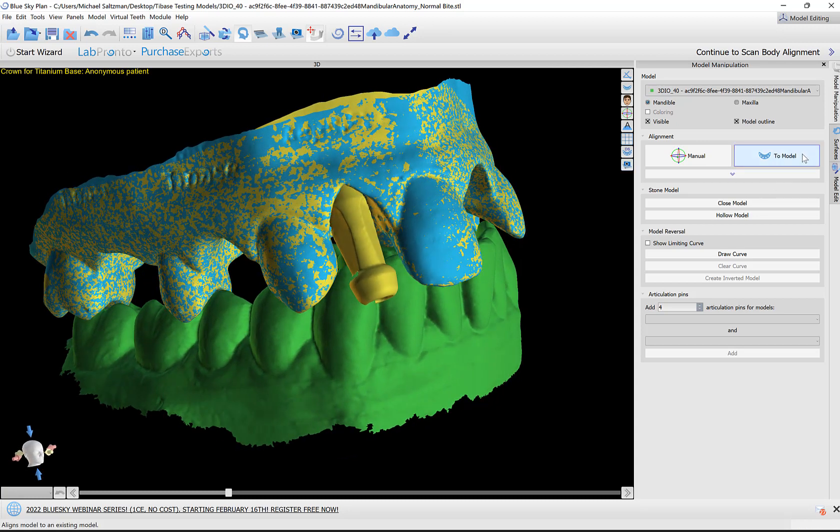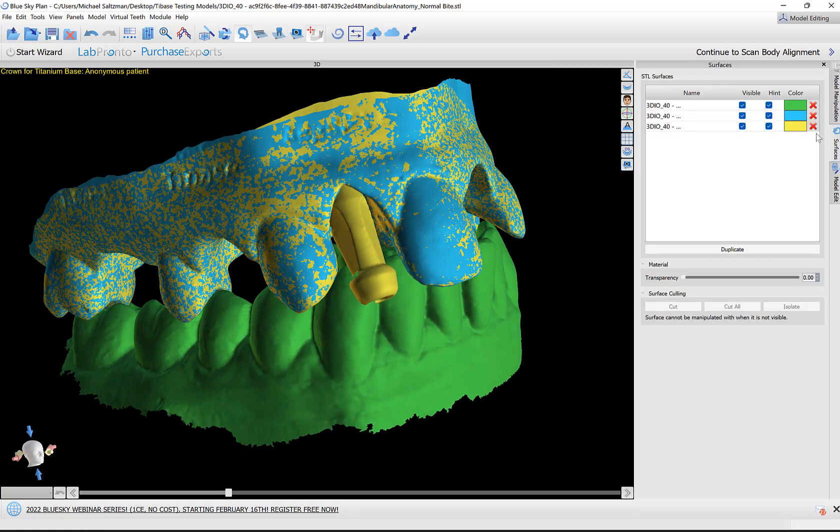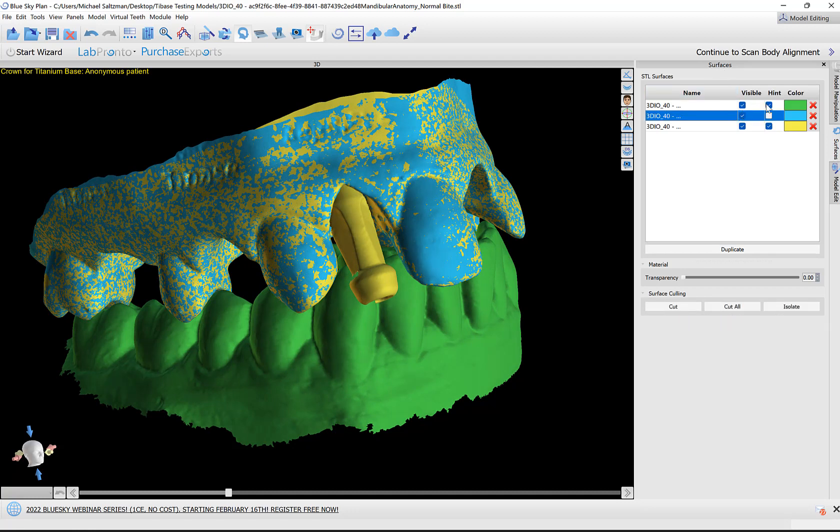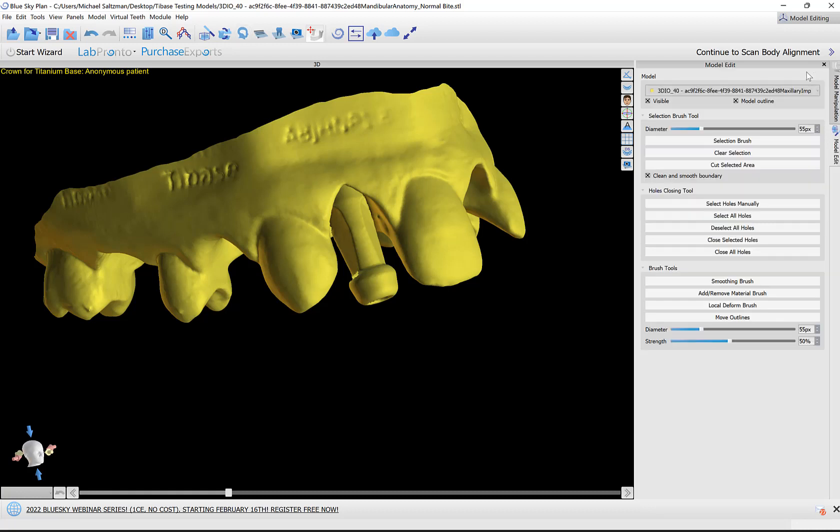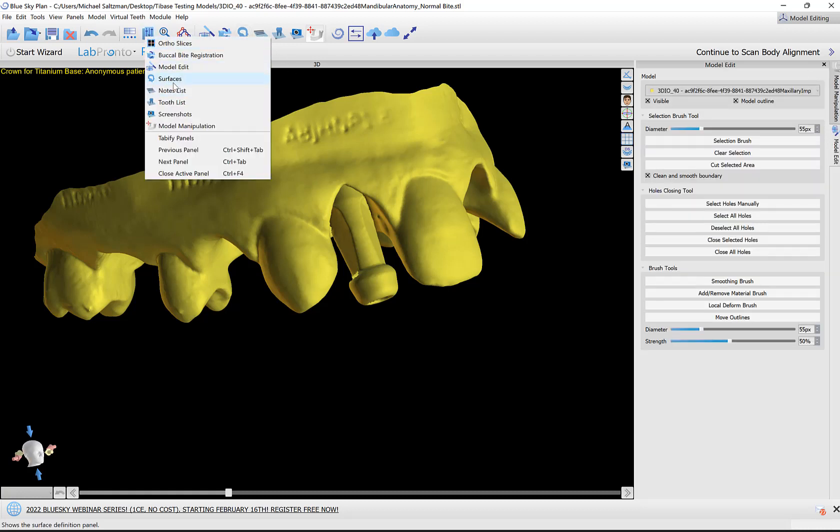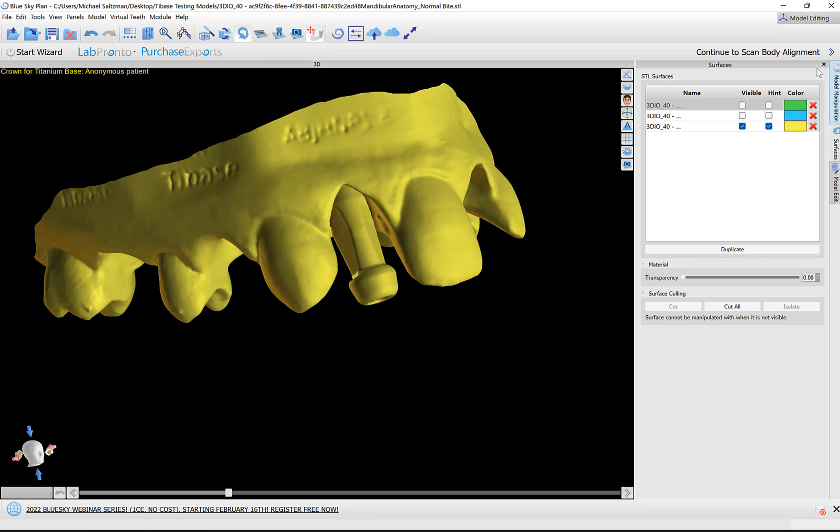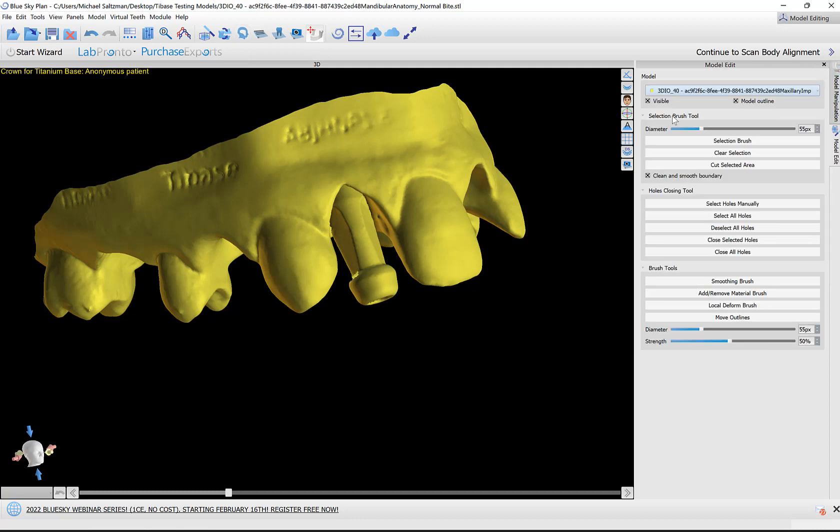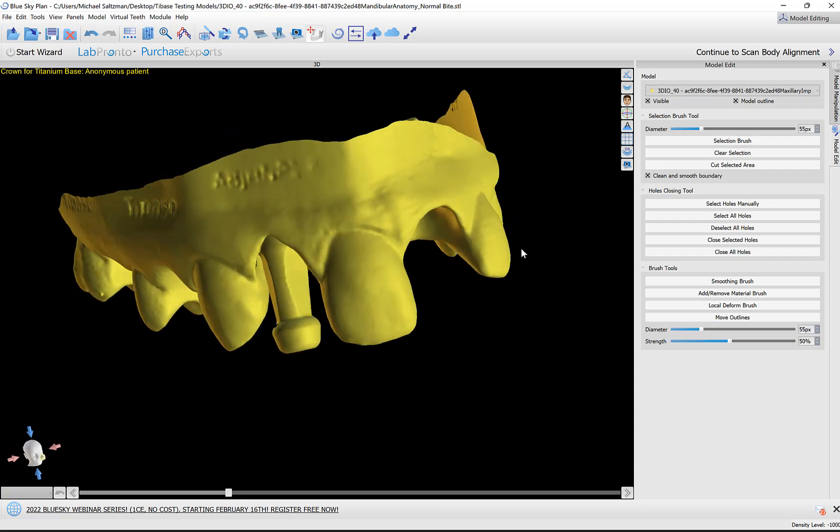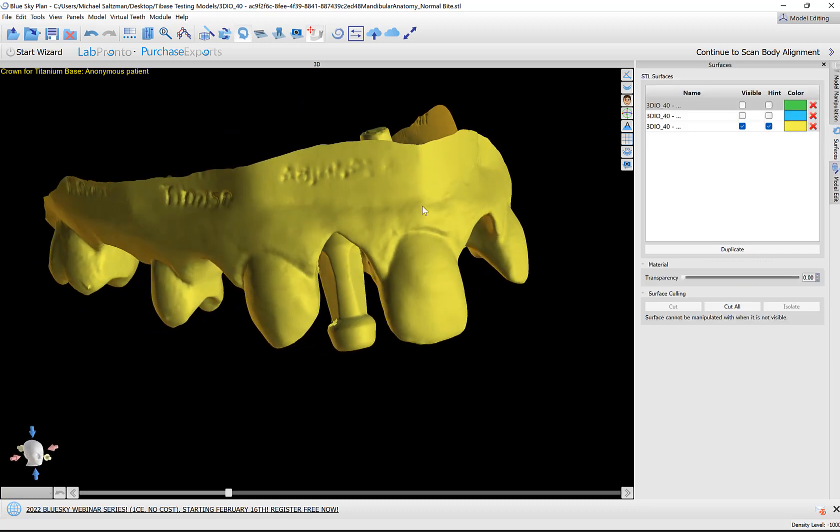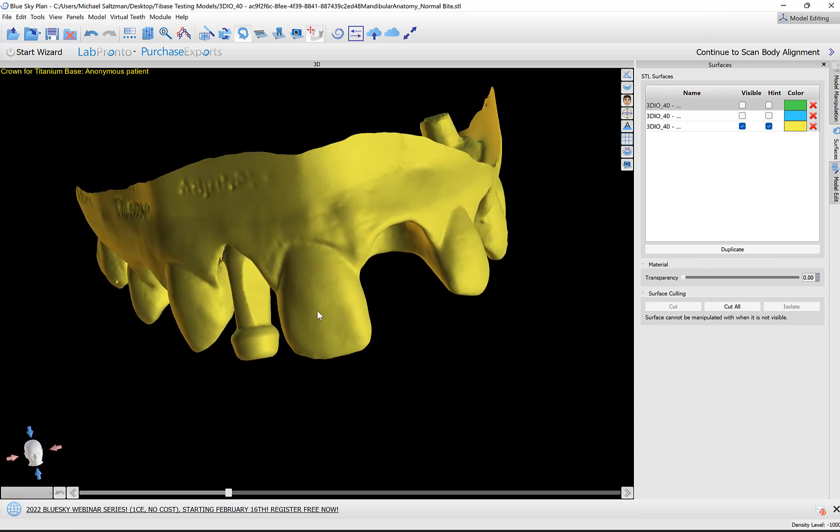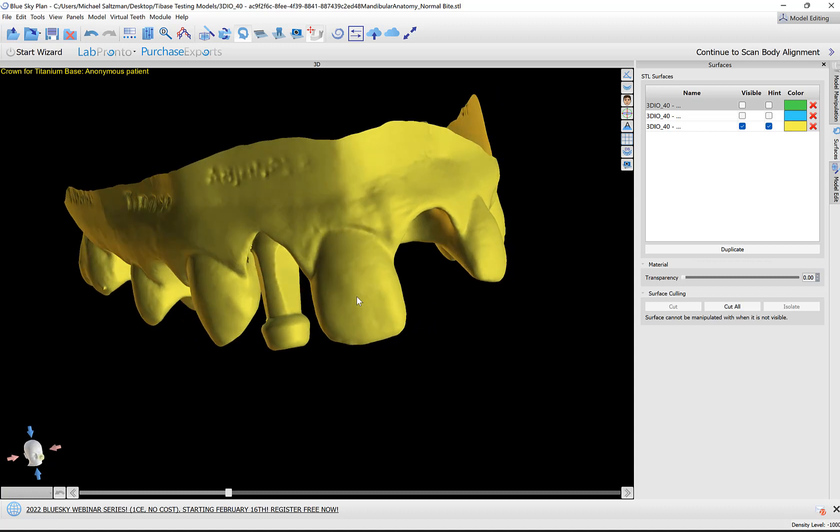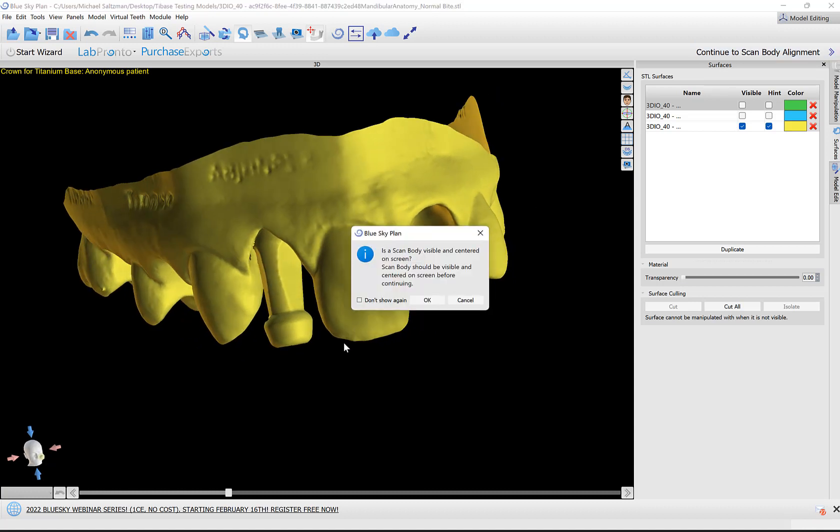Before doing so, it's a good idea to turn off any non-relevant surfaces by the surfaces panel. If any of the panels are not visible to you, then just go to the drop down and select the relevant panel. Or another tip: if you want to access the surfaces panel, for example, just double click on the relevant item and the panel opens for you automatically. We have our model visible on the screen. We're messaged here to confirm that the scan body is visible and centered on screen. I'm going to click OK to proceed.